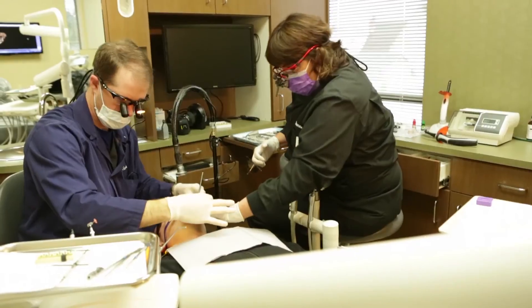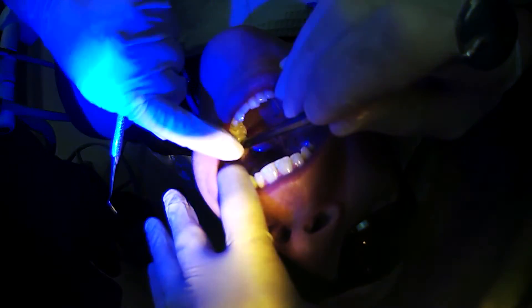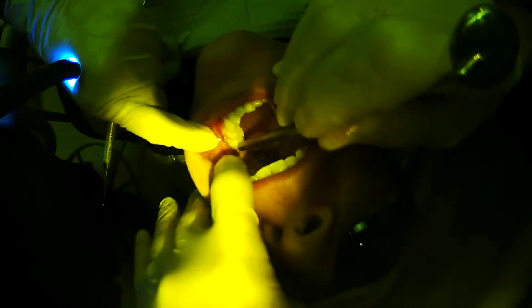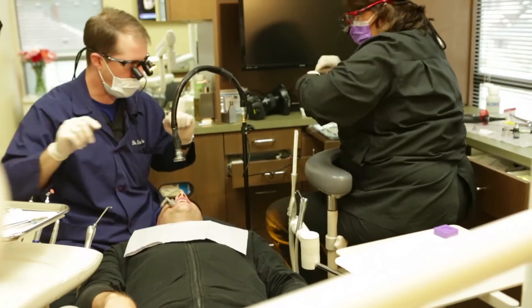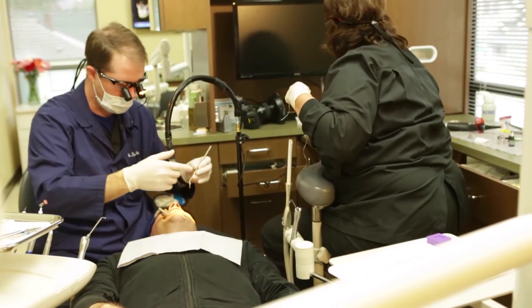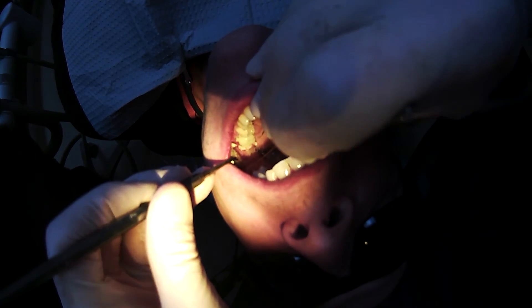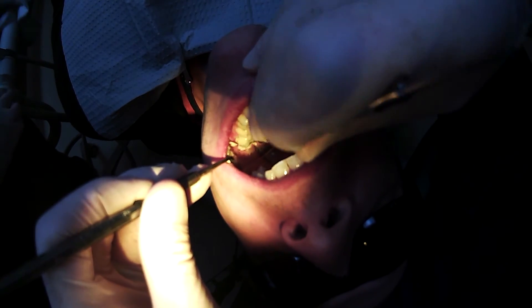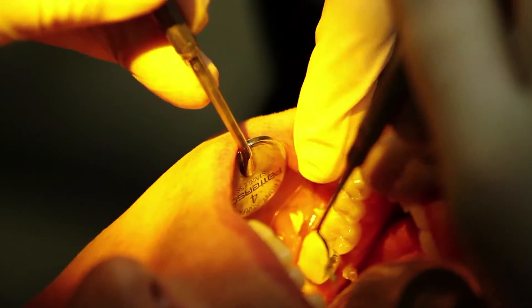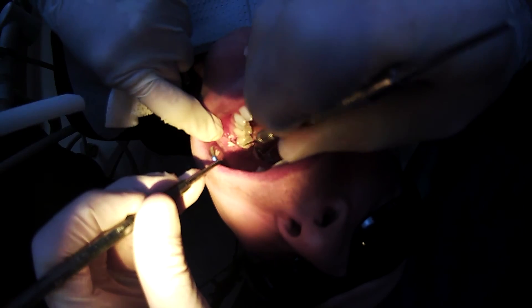Tana has loaded the crown. Hold it in place and she will tap cure it. You can wait two full minutes if you'd like. We go after our interproximals first — Tana's going to put her finger down and hold the crown because the cement is not set yet. I use an interproximal carver to clean the cement; it all comes off in one piece — look at the lingual, it just flakes off like that. We're going to pull our cord. If we get bleeding started now, we're already halfway home. It's sealed. Look at that margin — there isn't one. It's dead perfect.